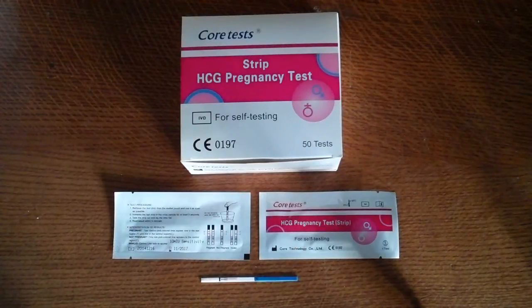So there will be a small percentage of pickup with these tests that subsequently do not develop into a full-term pregnancy. So it is important for all users, if they are screening with a 10 MIU ultra pregnancy test, to confirm the pregnancy has continued, that the implantation is successful, by retesting with a standard 25 MIU test membrane 24, 48 or 72 hours after their first pregnancy test has been performed.